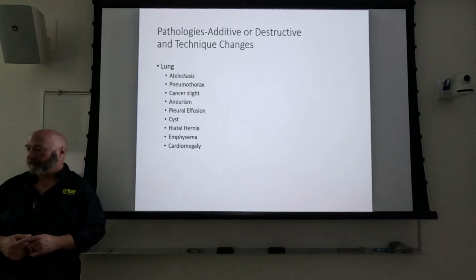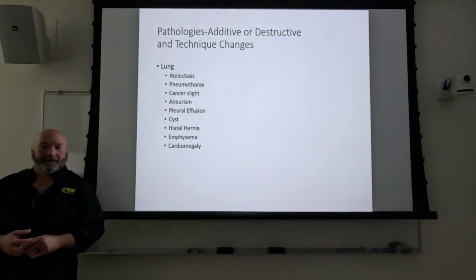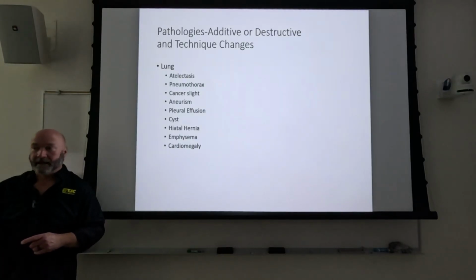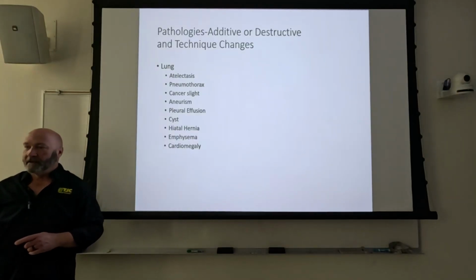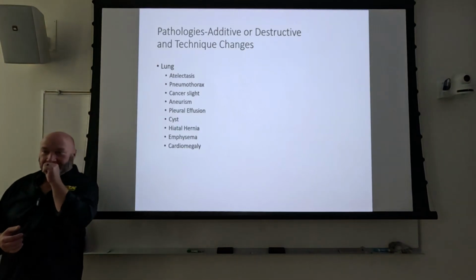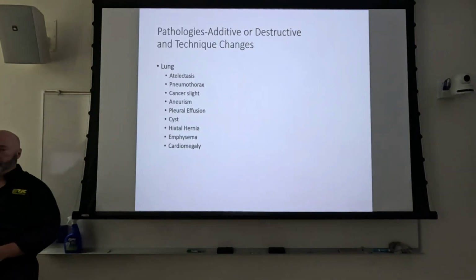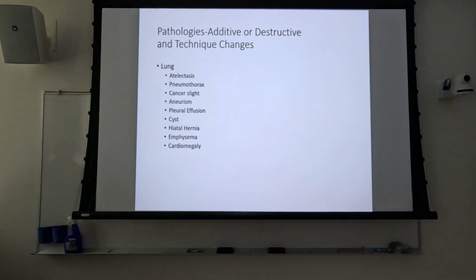Dr. Abernathy was a radiologist, a great radiologist. Actually, one you can work with pretty well. It's rare. But at any rate, he took him back to CT, and he personally did the injection over, and it was a limited injection. It took about a minute to inject it. He said if we'd have injected that patient with 100 cc's, it'd have gone on the table. He would have been dead in 6 seconds. So massive aneurysm. Did we need a different technique for it? No, it's soft tissue on soft tissue, right?